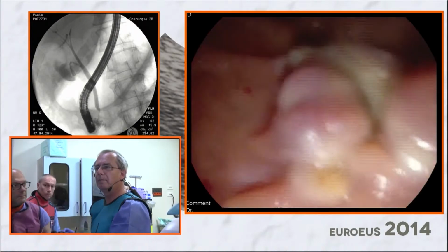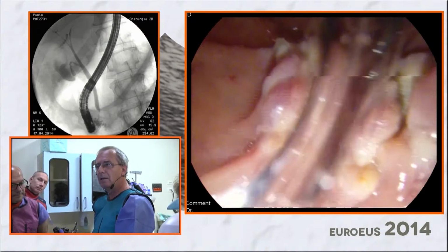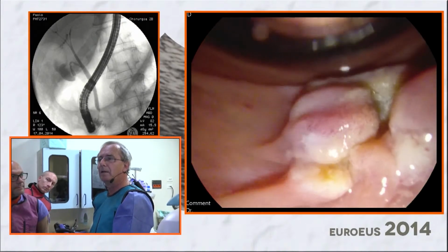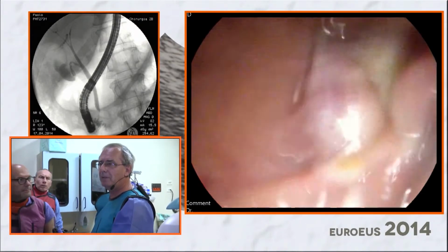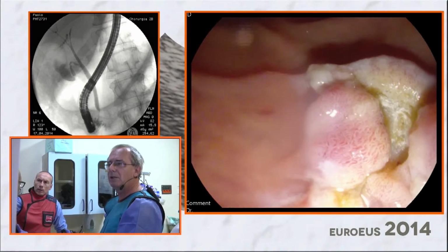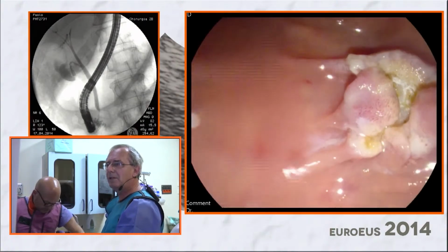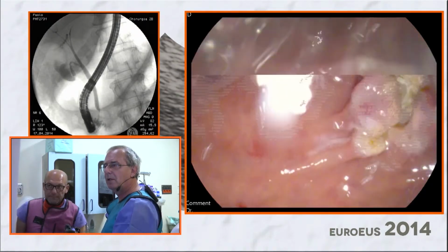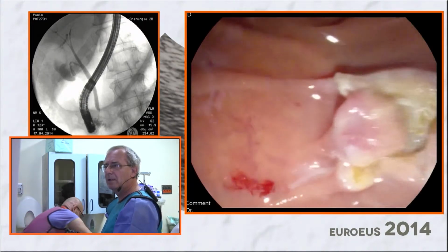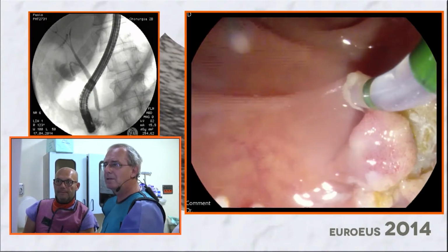Okay. So, see. Now we will check for the resection. There is some edema now because the piece we took out was quite thick, but this I think is normal tissue, what we see on the left side. What do you think? Looks only edema here. You see?